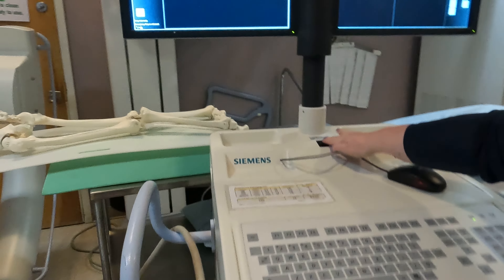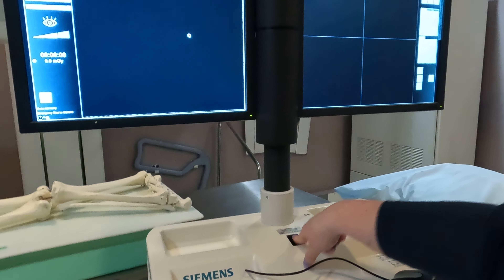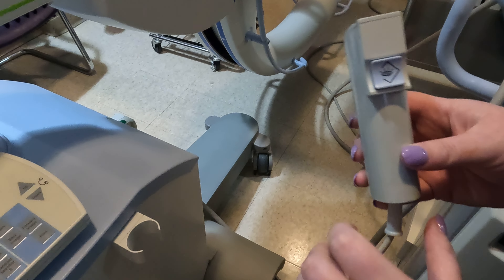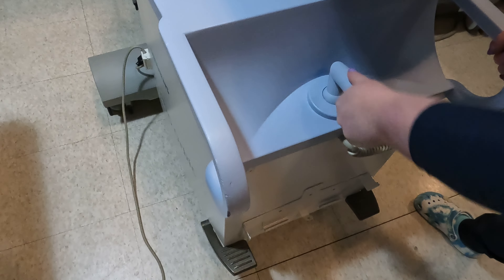This button will also bring your monitor up and down, which is good for tall surgeons. This is your exposure switch: this one exposes straight x-rays, and this one is more like a high-dose boost x-ray. For the wheels, if you pull up and turn, the wheels are free and you can move in diagonal positions. Down here is your lock — click down and it's locked, or release it to unlock.